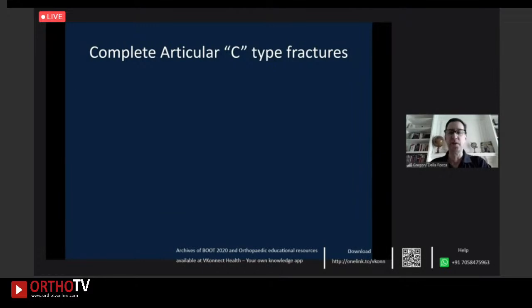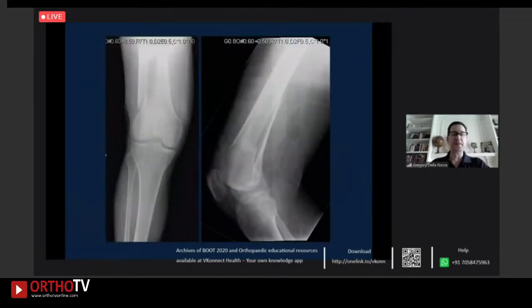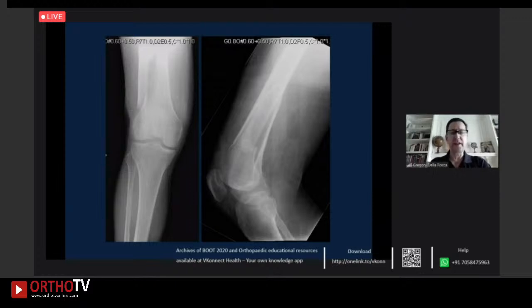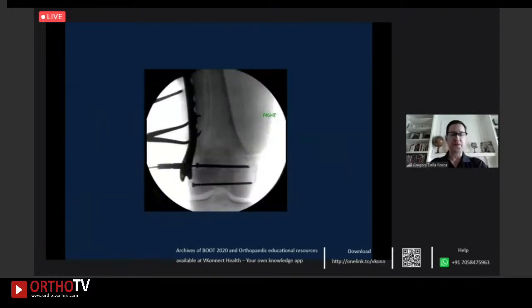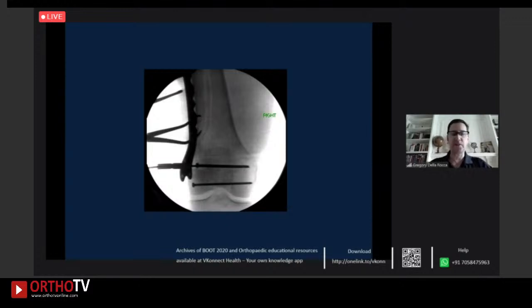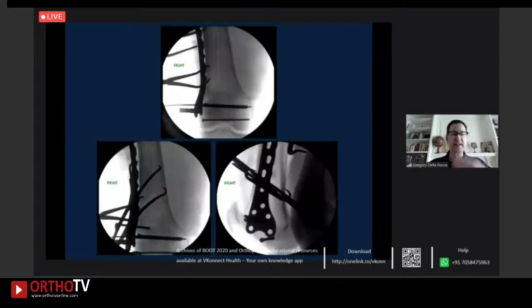C-type fractures have lots of articular involvement. A 35-year-old patient from a car crash with long extension into the diaphysis — you can see the articular split with a tiny bit of comminution on the AP image. Fixed using an open anterolateral approach to visualize the articular surface, reduce it, place lag screws, and apply a neutralization plate after clamping along the diaphysis.